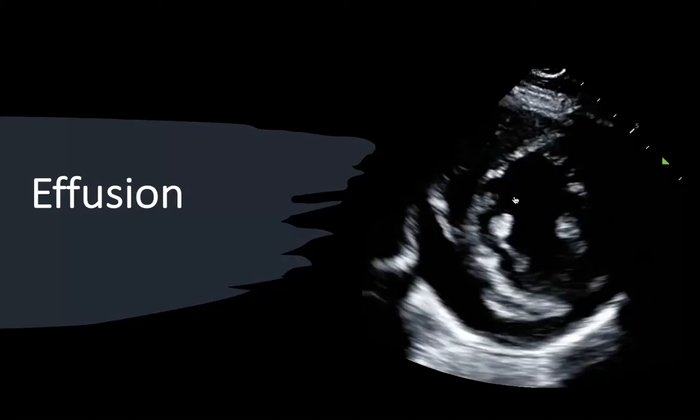So now let's move on to pericardial effusion. So how do we assess for effusion? Now, a pericardial effusion is fluid that accumulates in the pericardial sac around the heart. So the pericardial sac, if you remember from basic anatomy, has 2 layers to it that are usually adhered together unless there's fluid in between it that separates kind of in that space.